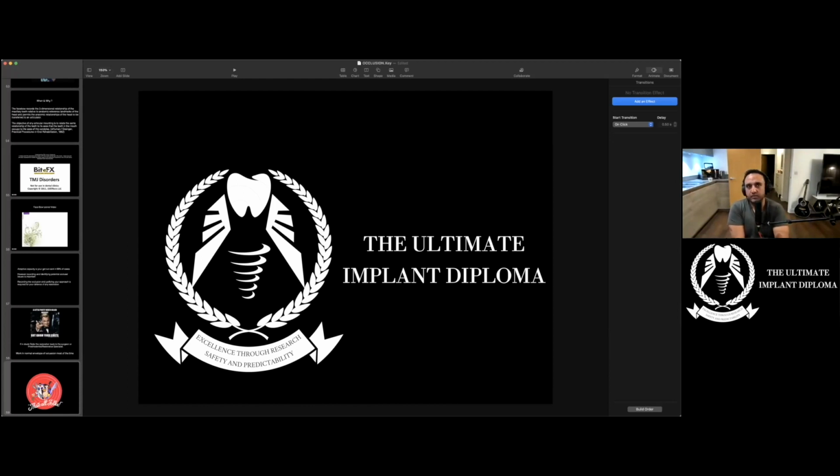So have I crept closer to 1.5 than a tooth? Hell yes. Have I put implants closer than 3 millimeters? Hell yes. Have they failed? Hell no. Right? They haven't. So it works. You can get them close, because everything, guys, you've got to think about, and girls, sorry, is in 3 dimensions. It's a cylinder next to another cylinder with a degree of bone in between. Now, the degree of bone depends on the effective blood supply.